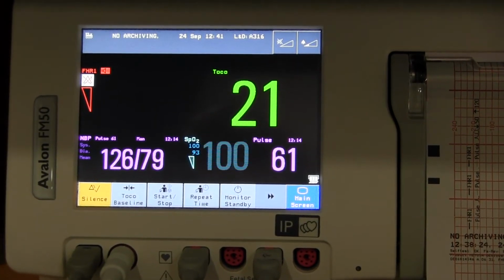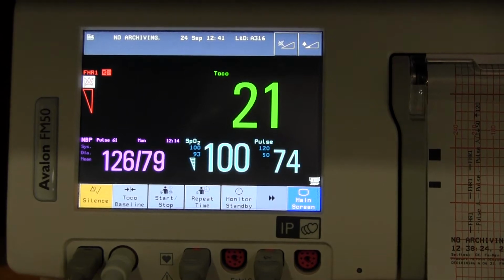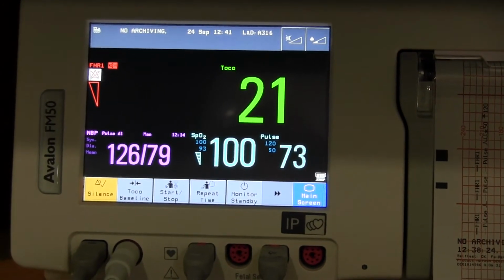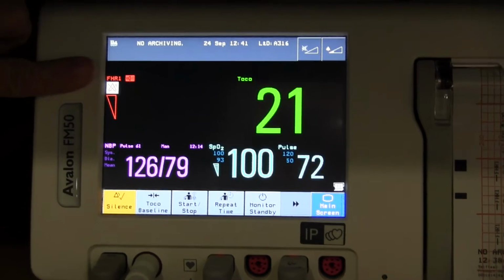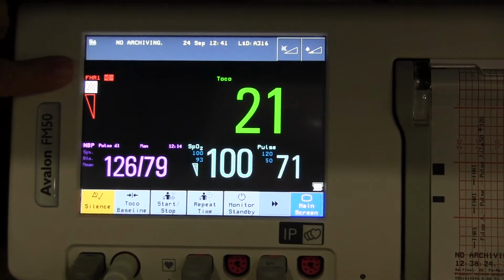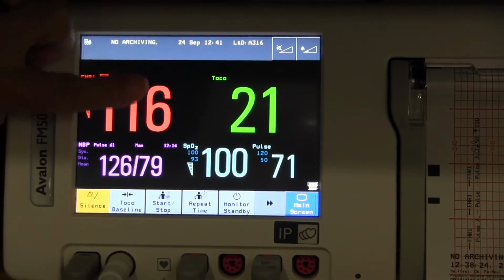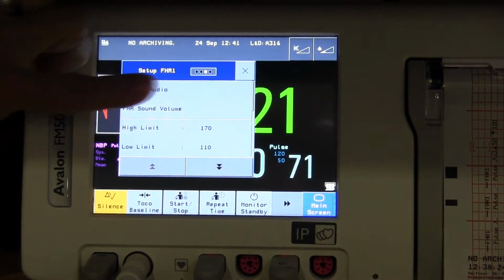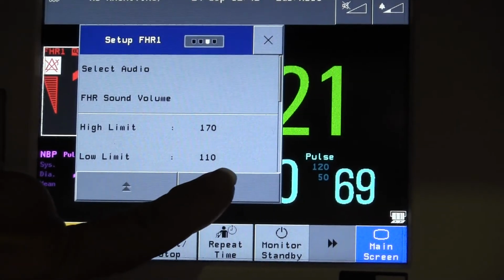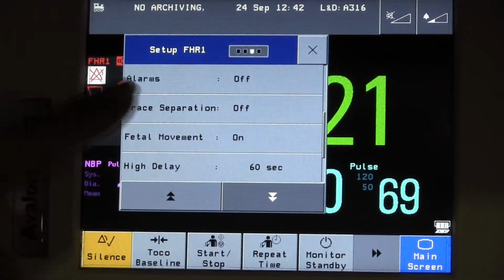Monitoring fetal movement. The fetal movement profile detects fetal movements on the FHR1 channel and marks activity blocks along the top of the paper. To use this feature, select FHR1 numbers to open the Setup FHR1 menu. Select fetal movement to be on.